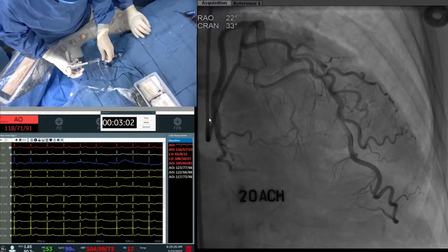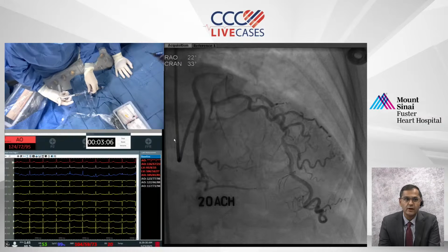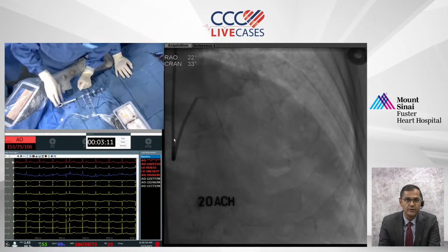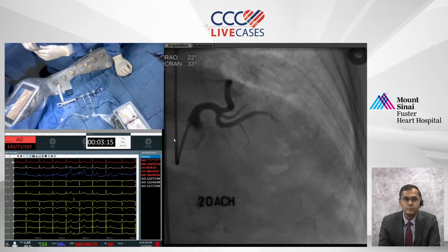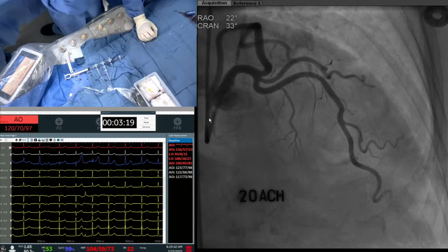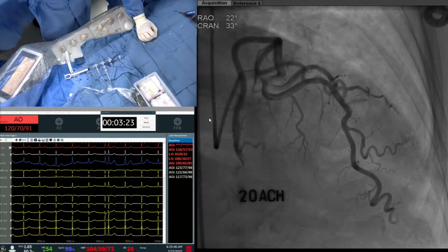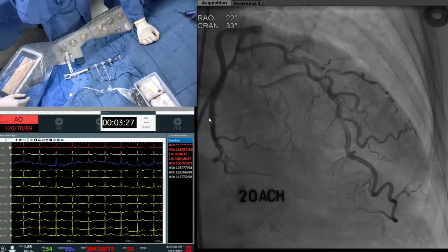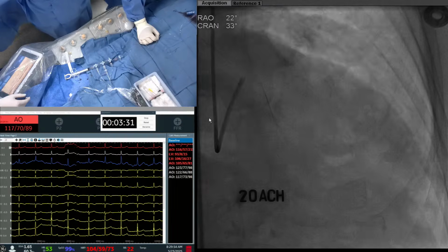Yeah, that's right. And the EKG placement with somebody on the table isn't always our standard 12 lead. And so I think ST depression is definitely part of it, and partially because of the localization of the leads. Yeah, and also, what we say a lot is you're dealing with a patient that's sedated. Are they going to be able to experience chest pain? Hard to say.